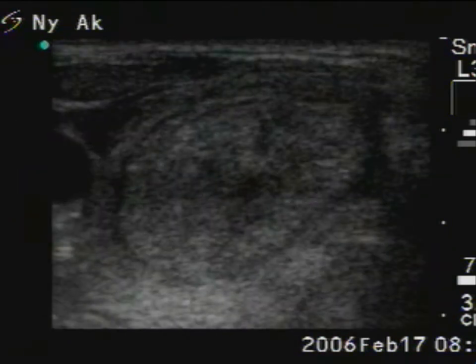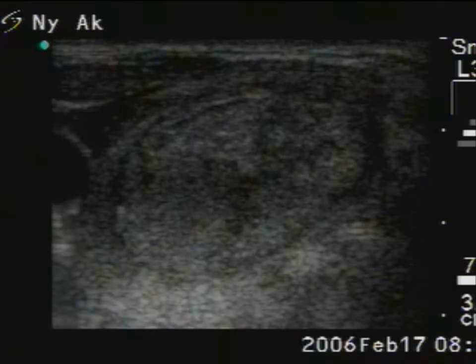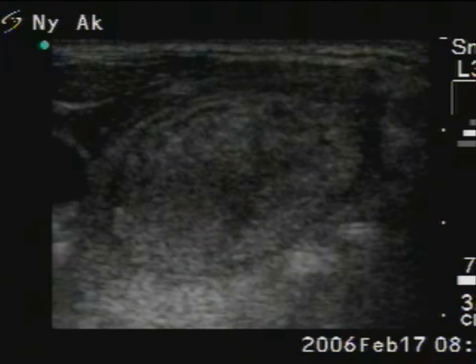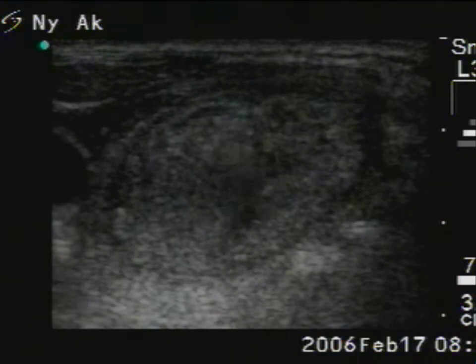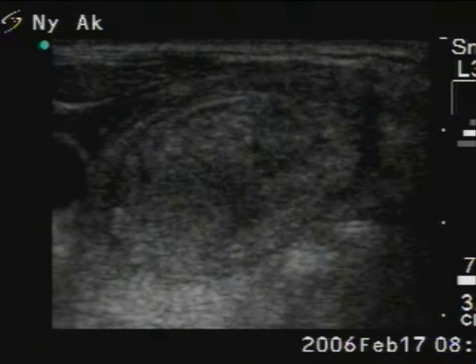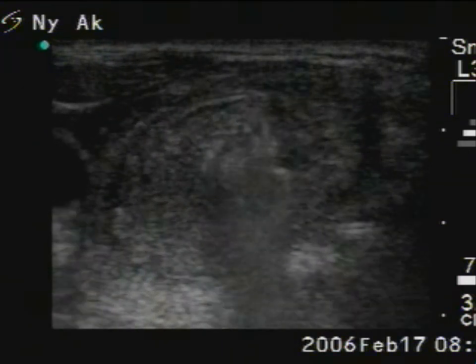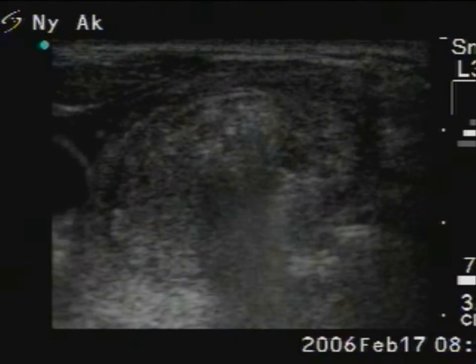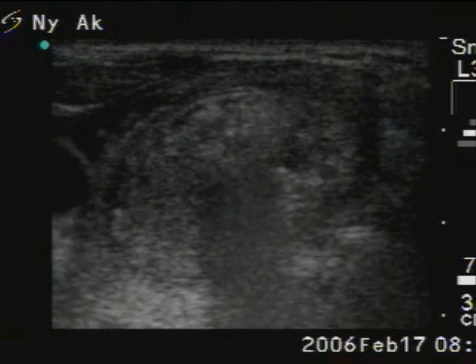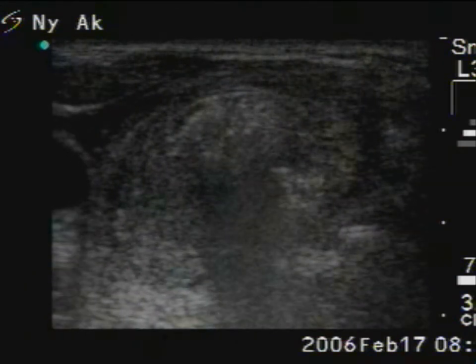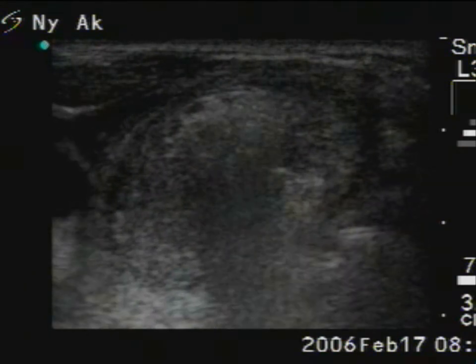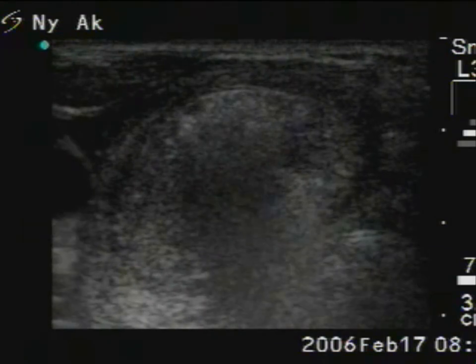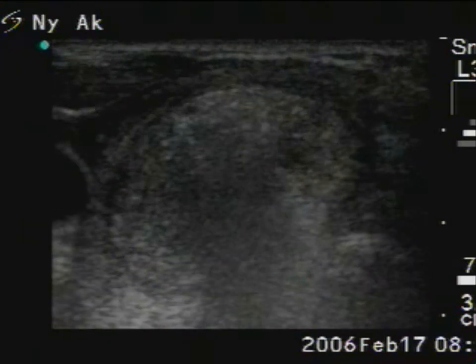At first, we inject ethanol into the central part of the nodule. The increasing mass in the dorsal part of the lesion corresponds to alcohol, while the increasing hypoechoic ventral mass corresponds to the solid part pressed to the ventral surface of the lesion.